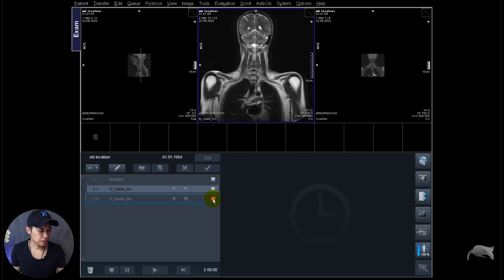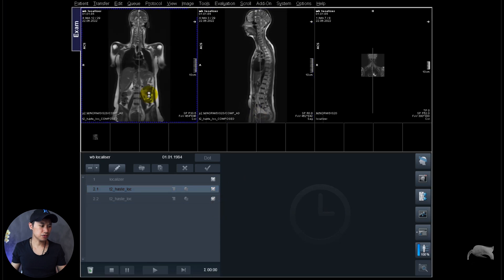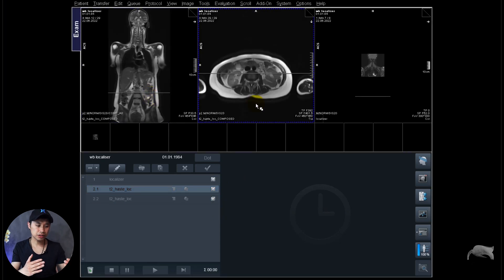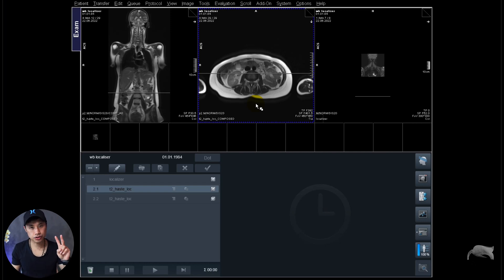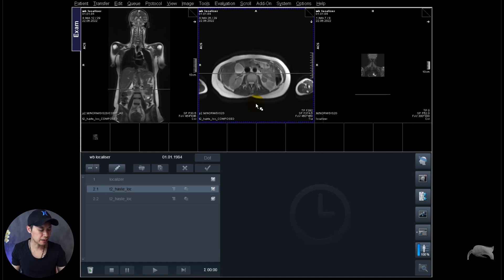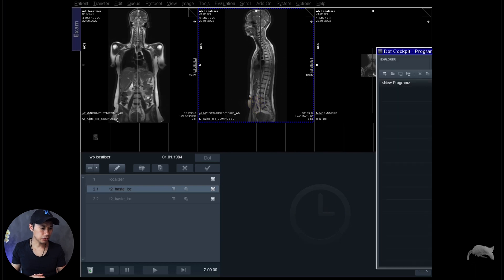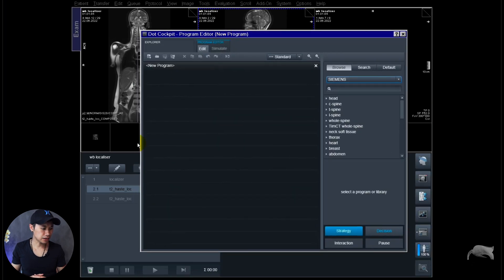But it doesn't matter, it's just a localizer, it doesn't affect whatever you need to see. So it's finished now and it's already stitched together. So we get a fast localizer for spine imaging or whole body imaging. So if you want to have more steps for like whole body imaging, just add on steps. This was just two steps, automatically inline composing. You want three, four steps, just do the same, it's the same principle.